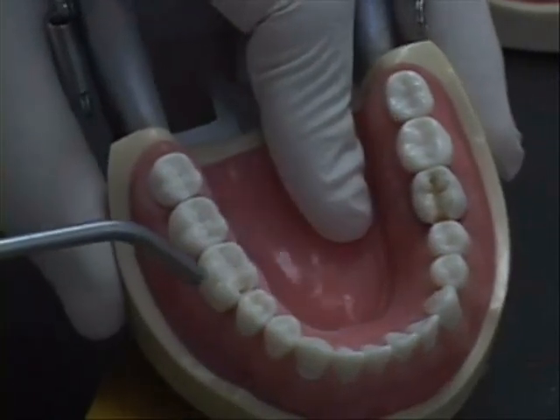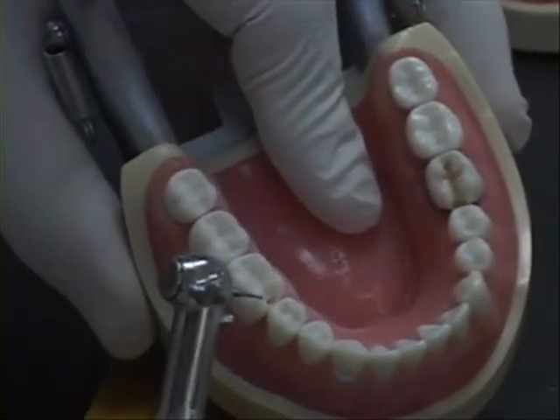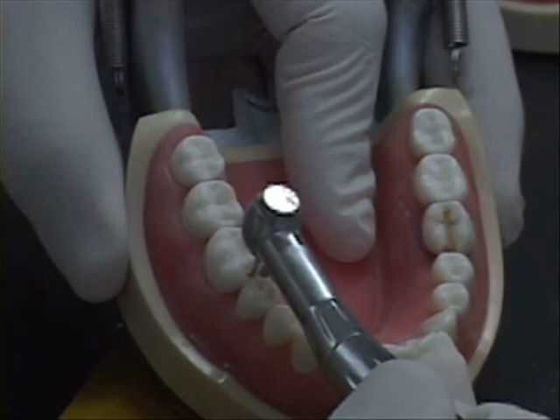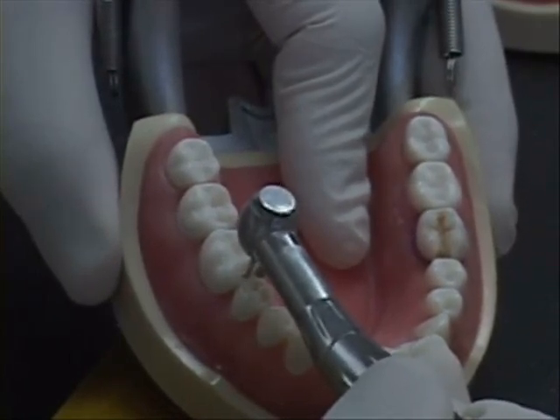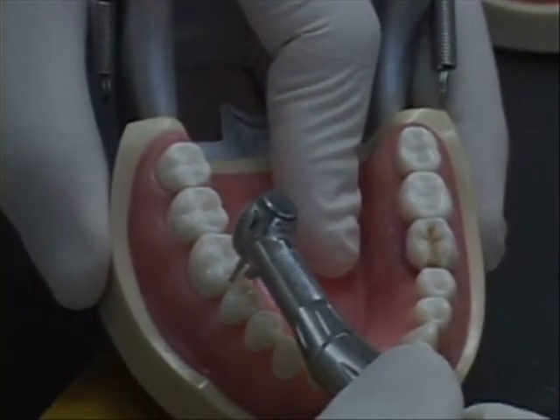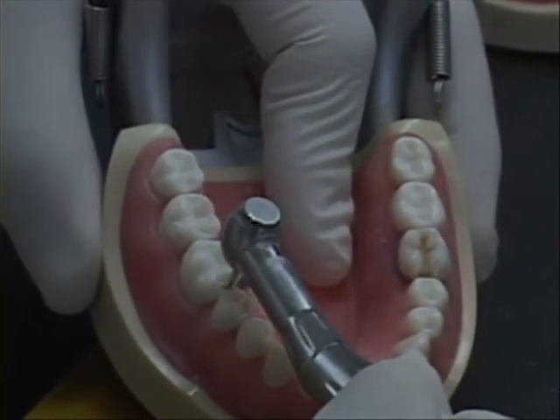So now we'll blow this through. And I cannot see that little window at all. So that means I need to go deeper until I get separation. Now I'm going to go down further. This comes up, lifts up a little bit. Smooth that facial wall and the lingual wall.